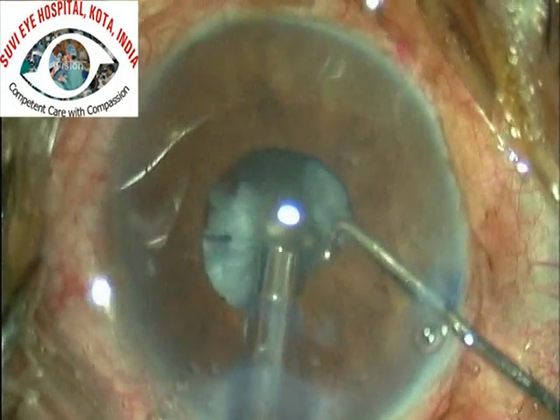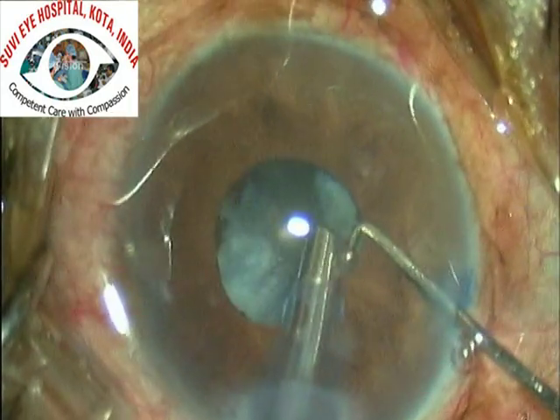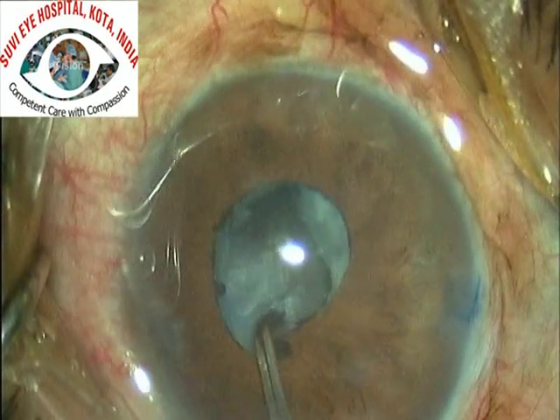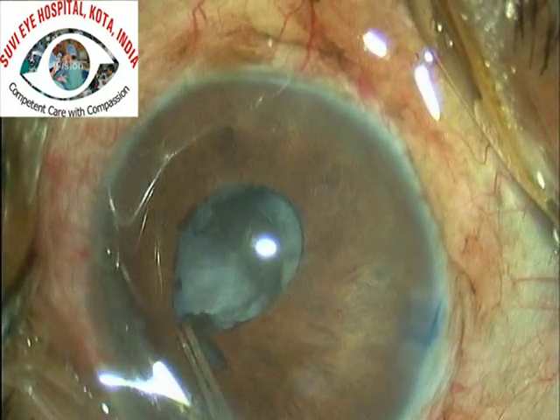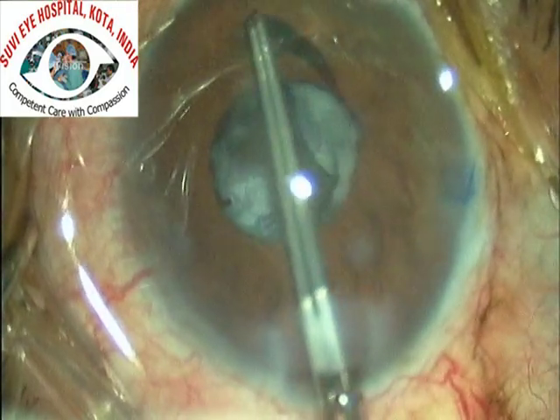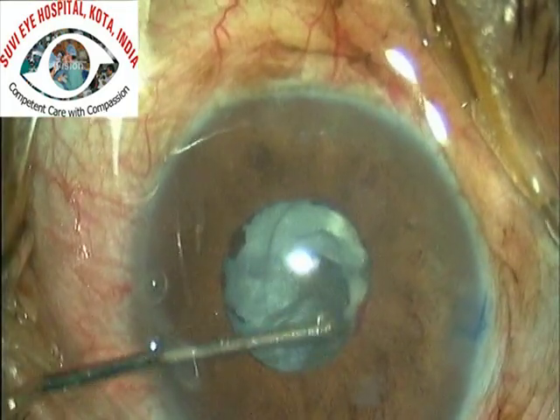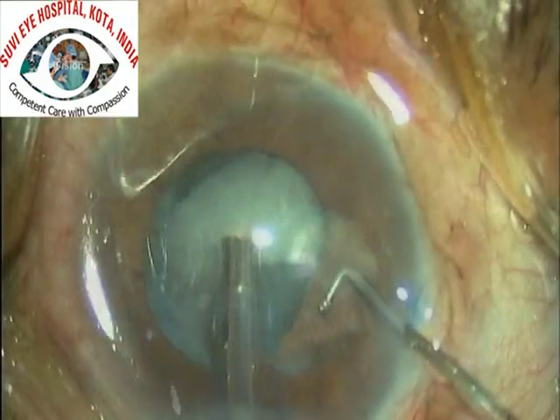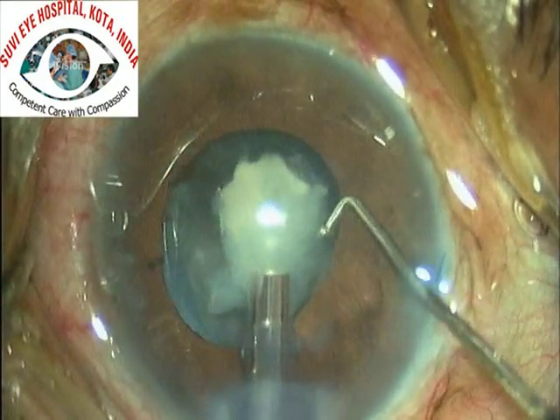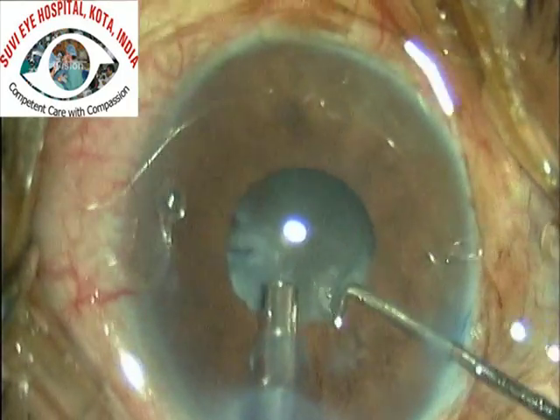Some of these cataracts may be partially absorbed and the posterior capsule may also have pre-existent defects, therefore we need to be careful while performing the surgery and be especially gentle towards the posterior capsule. Nuclear rotation again needs to be careful, especially when a posterior capsule tear or dehiscence is suspected, and movements should be gentle compared to any routine case.